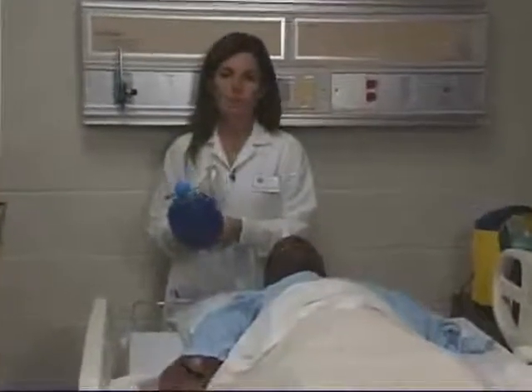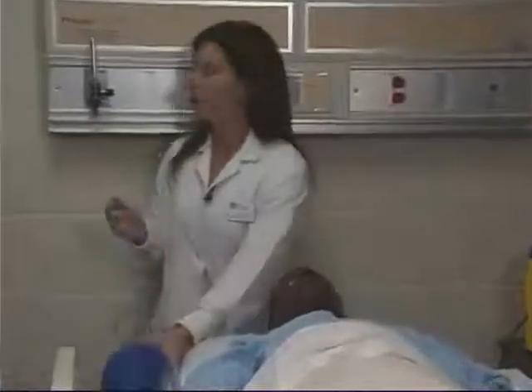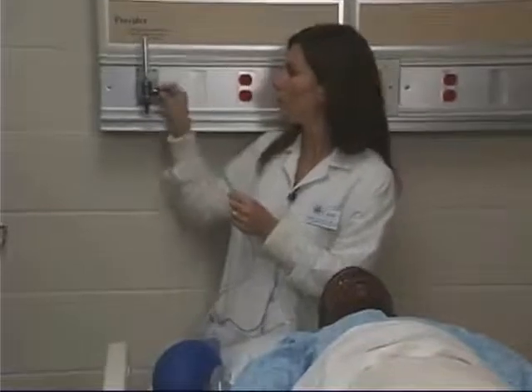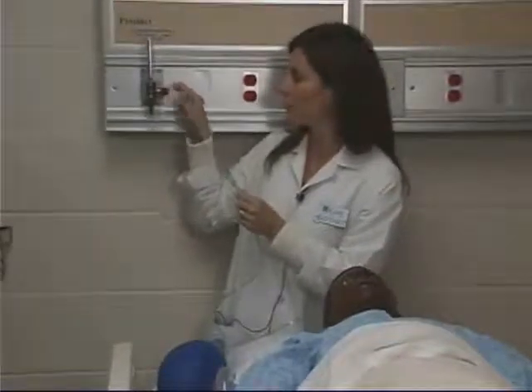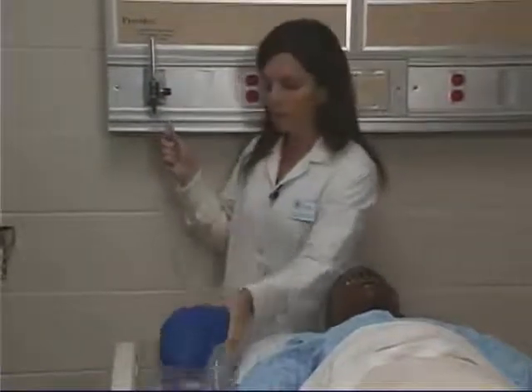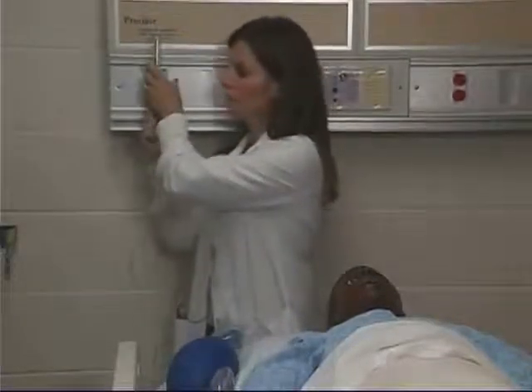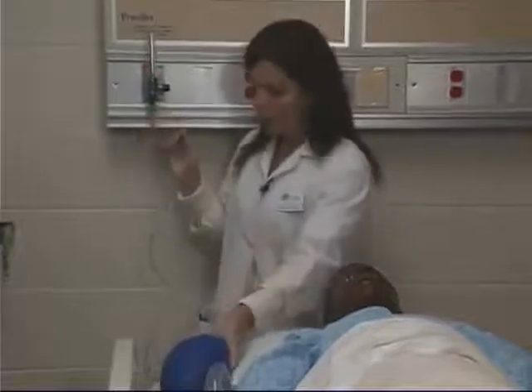Hi, my name is Gina Luciano, and I'm going to demonstrate today the bag valve mask. The first thing you want to do is turn your oxygen flow meter on the wall flush all the way up to 15 liters per minute. Make sure your oxygen is flowing and hook up your source. When you hook it up, you should see oxygen flowing in your reservoir bag.